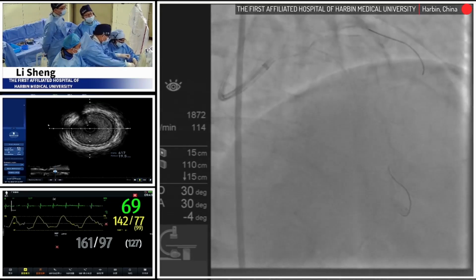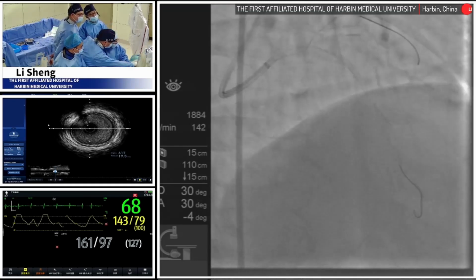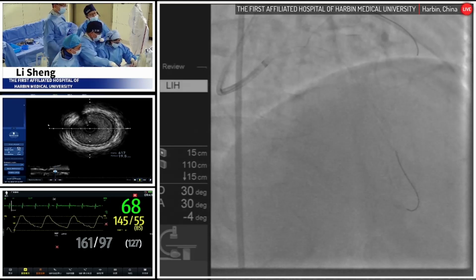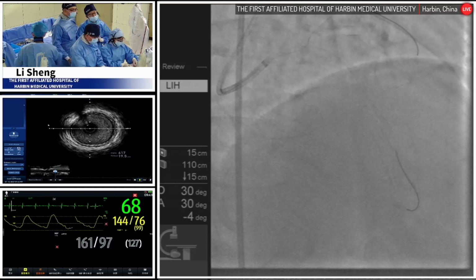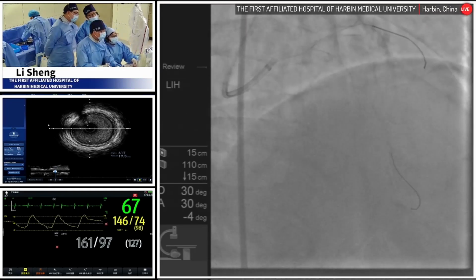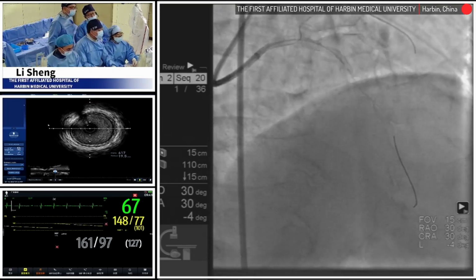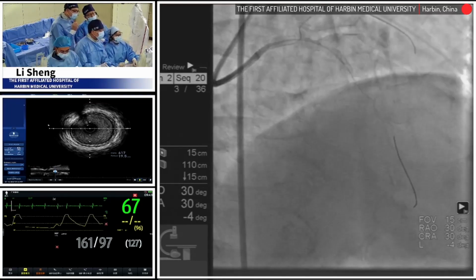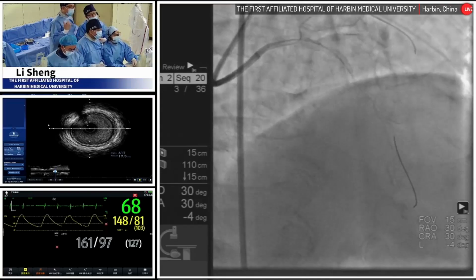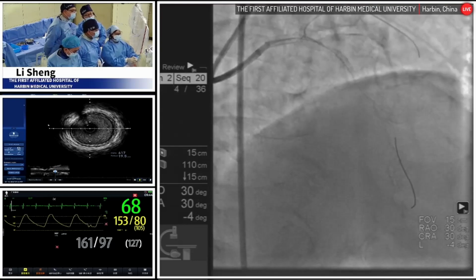No, I'm not satisfied with the stent, but I think this just shows why we chose the cutting balloon or NC balloon, not rota. Indeed, the stent is under expansion, but the unsatisfied part is caused by the calcified nodule, not the 270-degree circle.